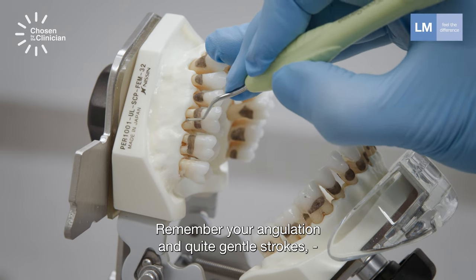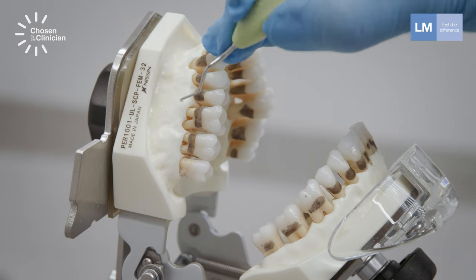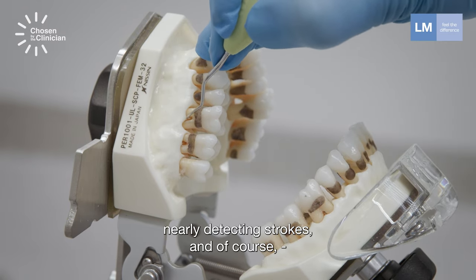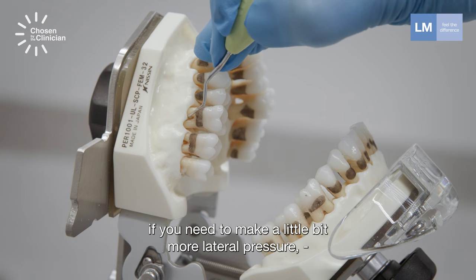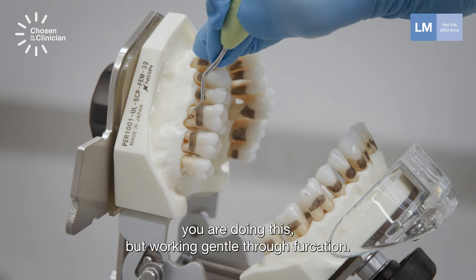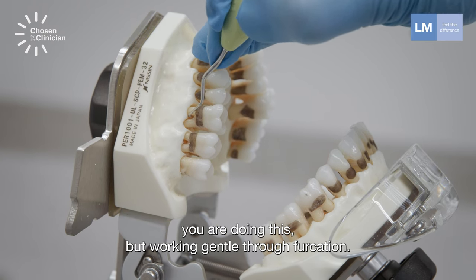Remember your angulation and use quite gentle strokes — nearly detecting strokes. And of course, if you need to apply a little bit more lateral pressure, you can do this, but work gently through furcations.